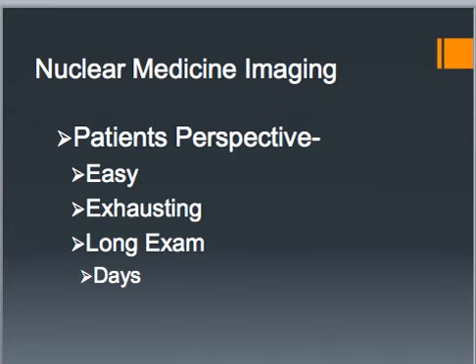So imaging may be done immediately after the injection, inhalation, or ingestion, or a couple hours later, or they might wait for days later. It just depends on how long it takes those radio tracers to get to the area of interest. So it's going to depend on the scan.